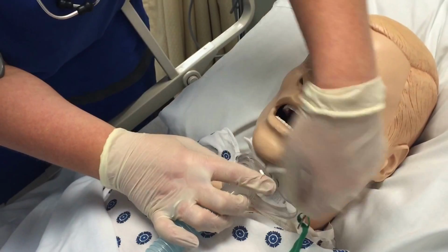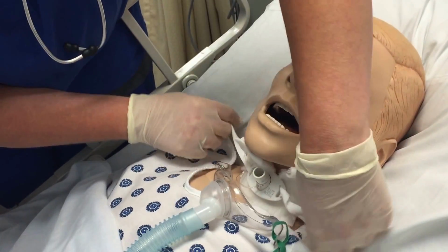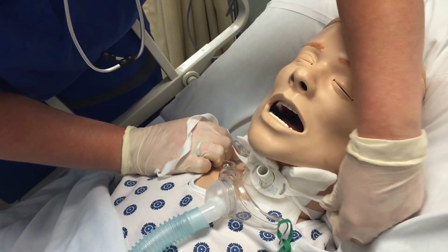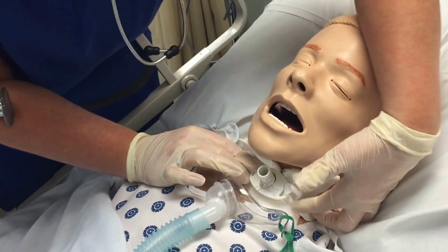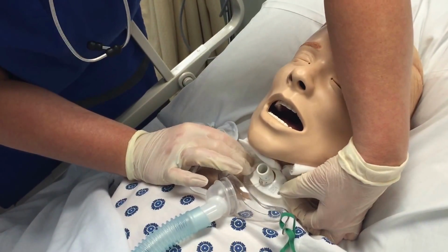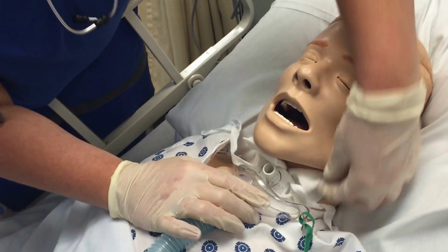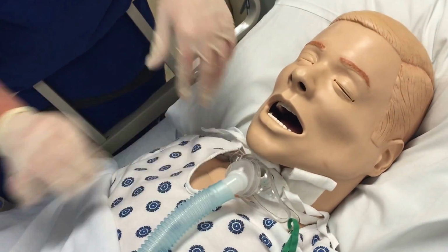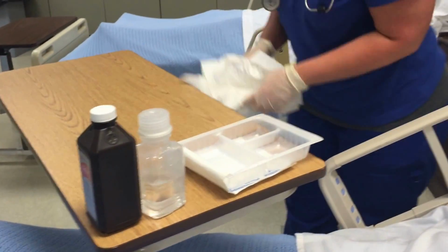Also at this time, if their trach ties need to be replaced, you're going to replace them. But you're going to get a second nurse to help you because you don't want this to become dislodged. So you want to grab another nurse and they're going to help hold this when you change your trach ties. So there will be another one involved. All right, Miss Dan, it's all done. I'm going to clean up my mess.